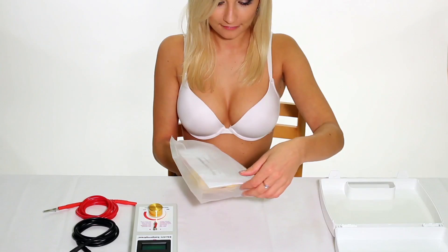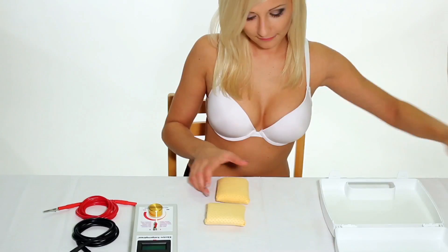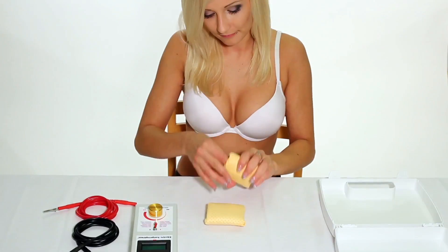First, carefully remove the comfortable armpit adapters to electroantiperspirant device from original packaging along with the enclosed manual.